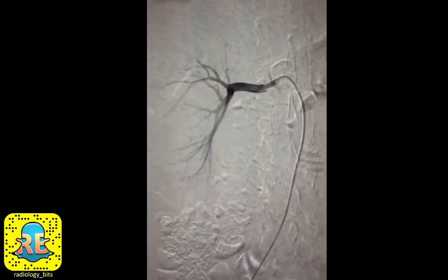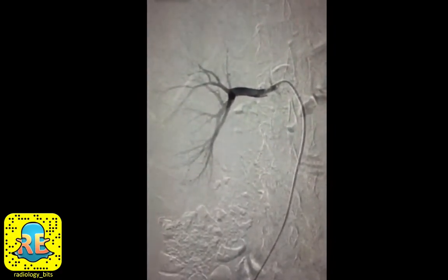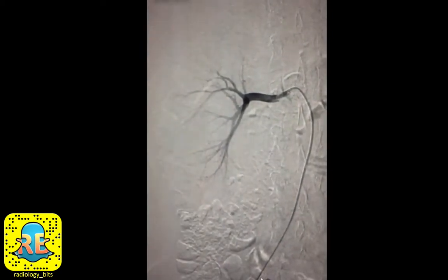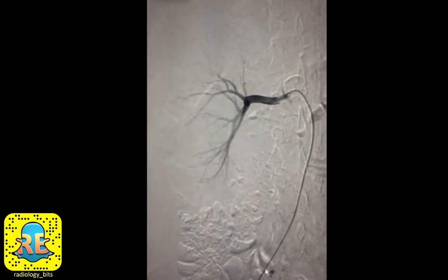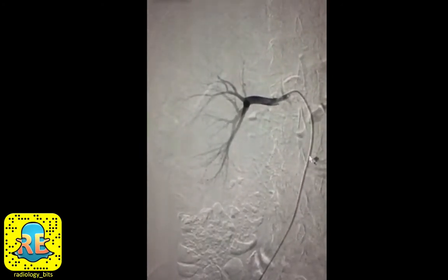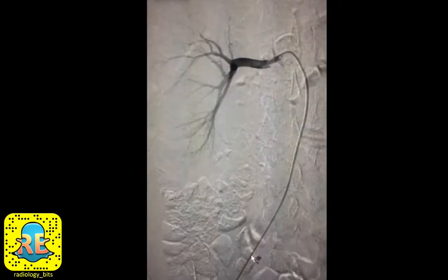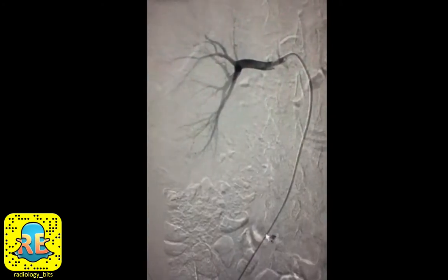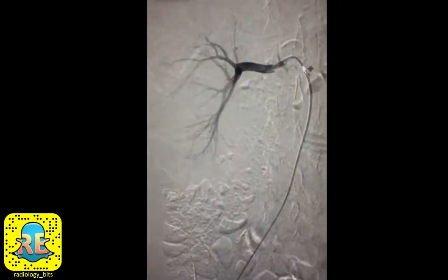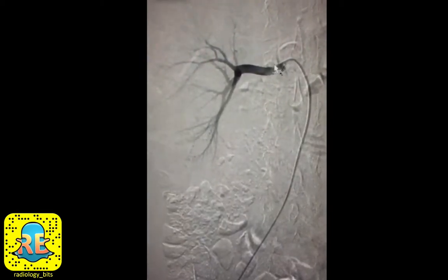I'm sure that today's case would be interesting to both seniors and juniors alike. This is a catheter angiogram where the catheter is introduced via the femoral artery, going to the iliac artery, reaching the aorta, and then selectively introduced into the right renal artery.